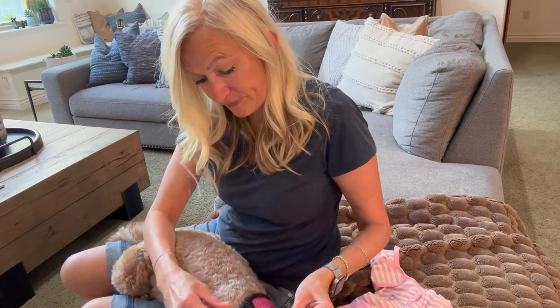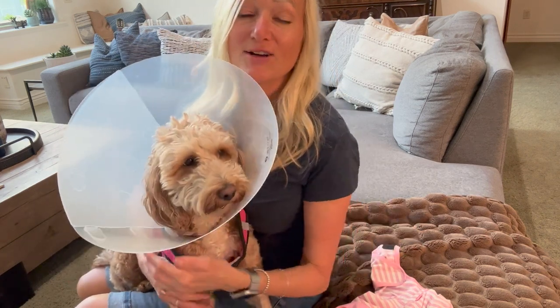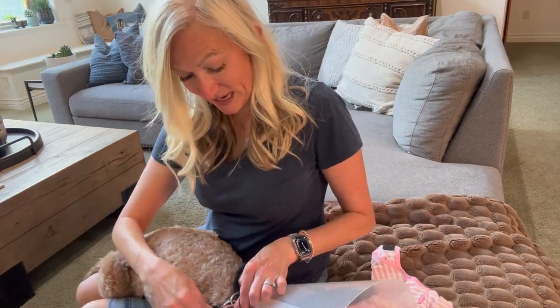She can't get it off like she did with the collar — it's much more secure. So there's the cone: a better way to wear it is with the harness. But Adelie also told me that there's a recovery suit called a surgery recovery suit for dogs, and it's on Amazon — I will link it because this has been a complete lifesaver.